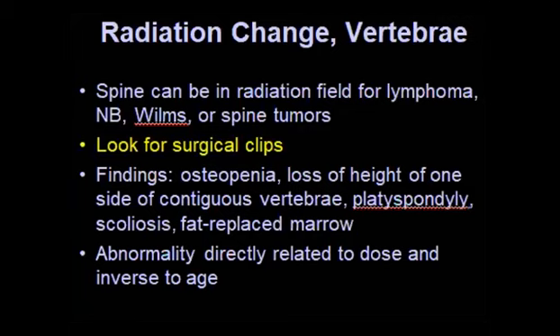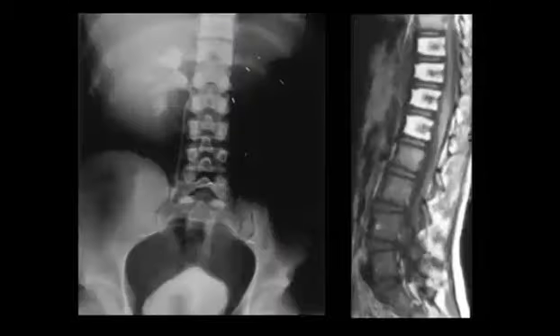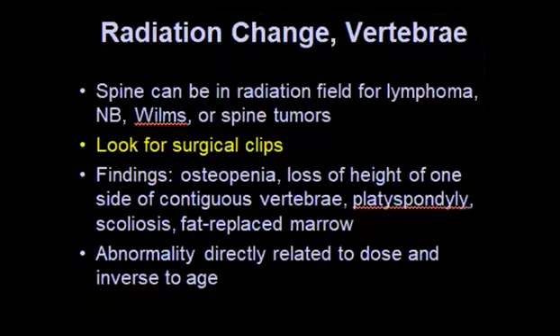Marwa, yeah, RCC can happen in the pediatric age group. I ask you, can it happen, Marwa? Because you said maybe left RCC. Can it happen in the pediatric age group? Yeah, very rare. So go to the common, okay? Better, because the examiner, if you tell him this as the first differential, I think he will not be very happy with it. So yes, Wilms is better, I think.